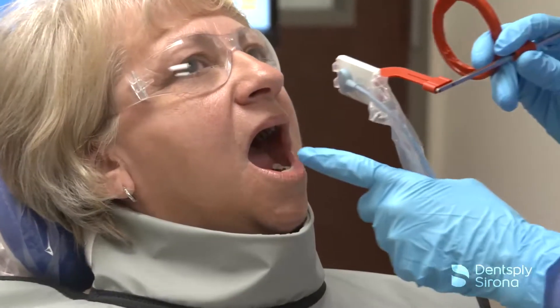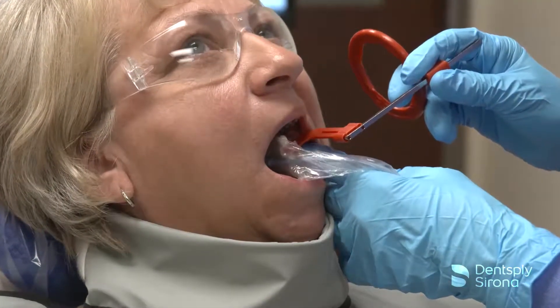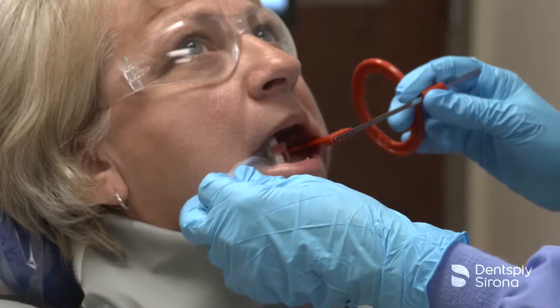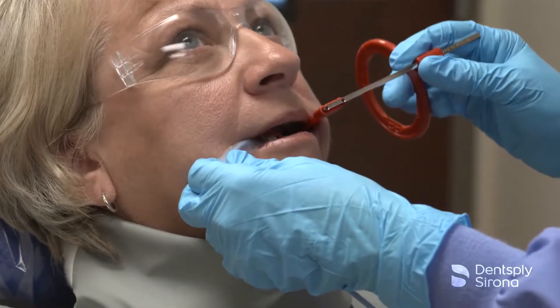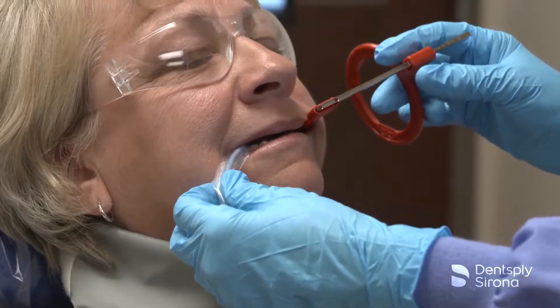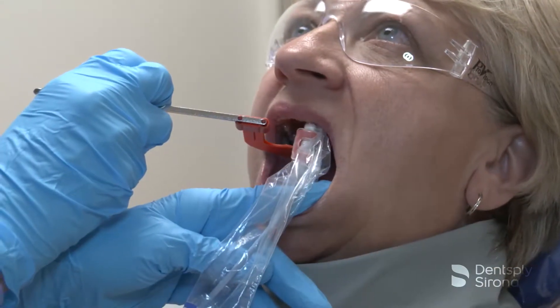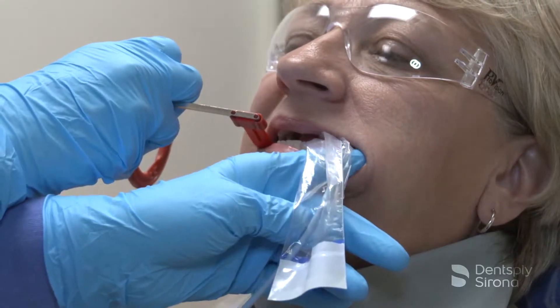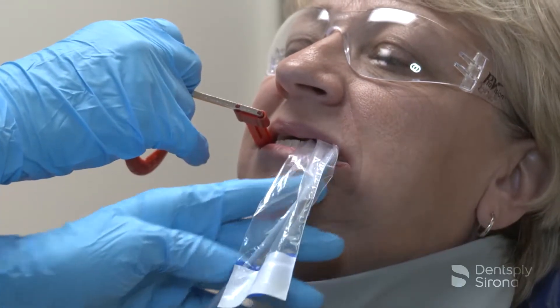Similar to the premolar bite wing, the central ray must be perpendicular to the image receptor when placing the molar bite wing. It is essential to include the distal most portion of the second molar, or third molar if present. When placing the sensor, allow the sensor to find its way in the mouth, and just prior to having the patient close, gently shift the holder as far distally as the patient will allow.